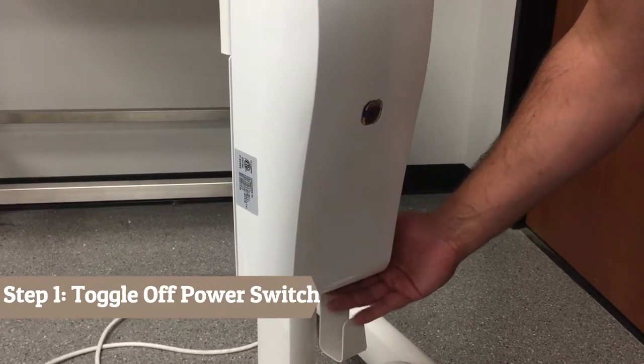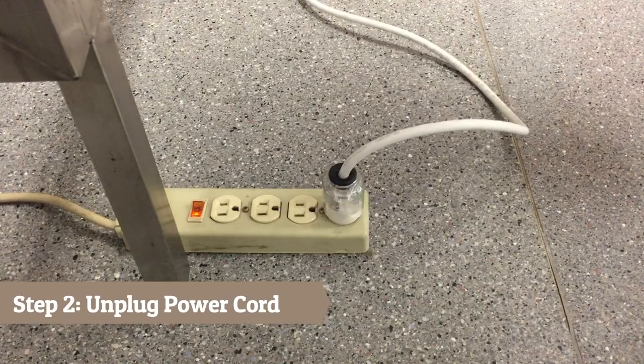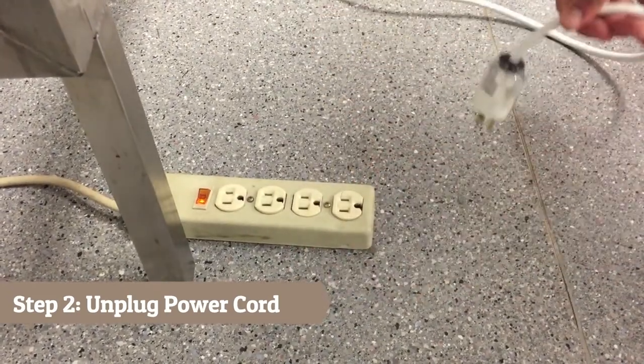Step 1: Turn off power at the power switch. Step 2: Unplug the power cable at the power outlet.